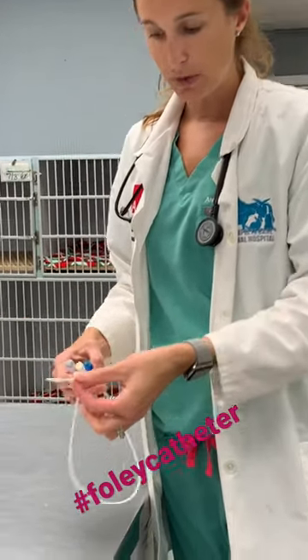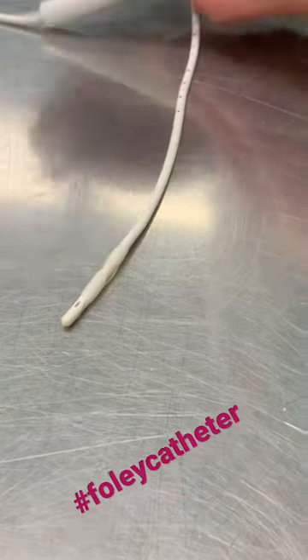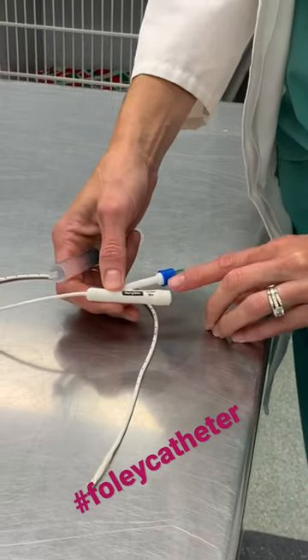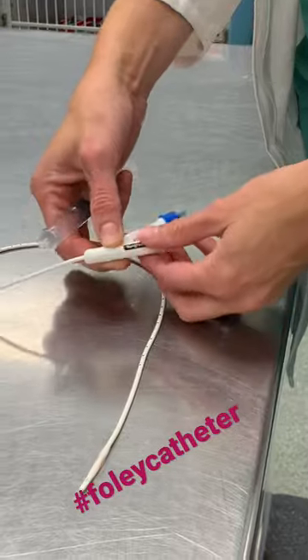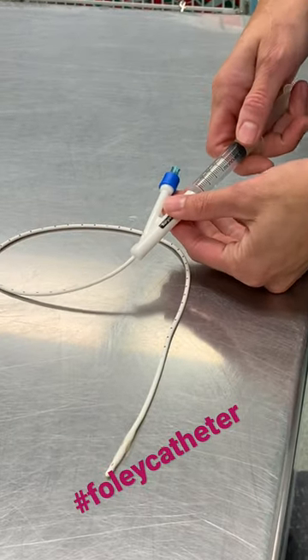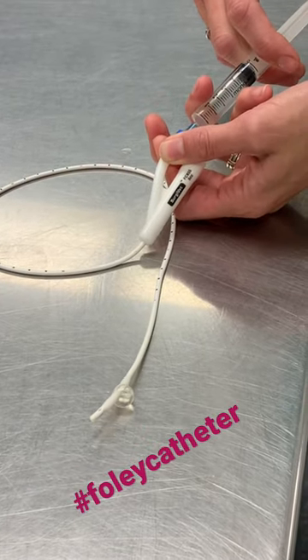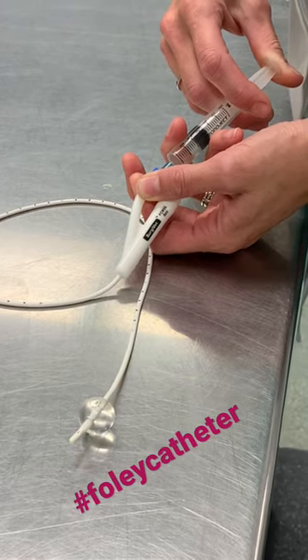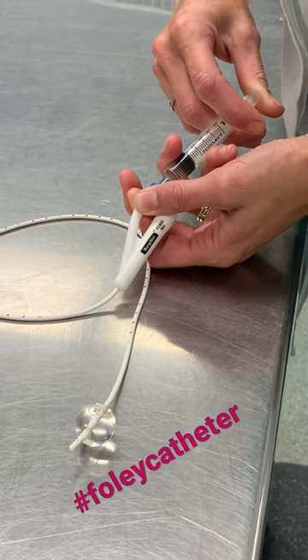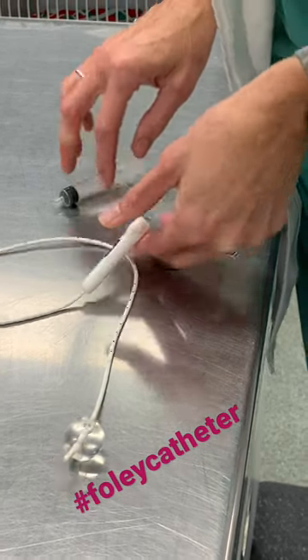This is a Foley catheter — it has a little balloon on the end. Once we place it into the animal's urethra, in this case through his penis, we use a syringe to inflate it. All Foley catheters tell you how much liquid needs to go in. When it's in a patient, we use sterile saline, connected here. As you can see, inflating this balloon is what actually keeps the catheter in place inside the patient. This is a 5ml one, so there's 5ml in here.